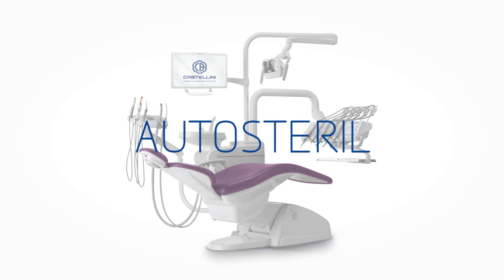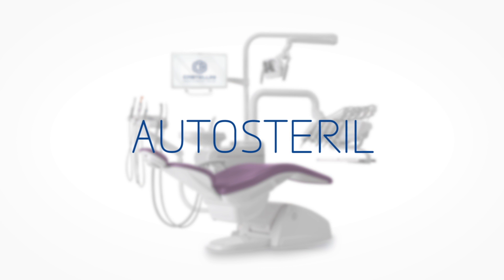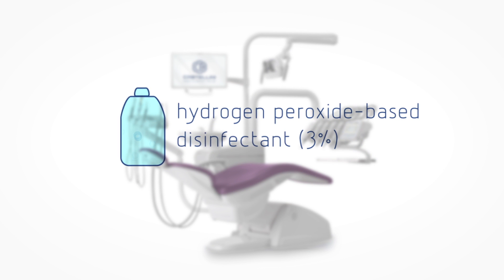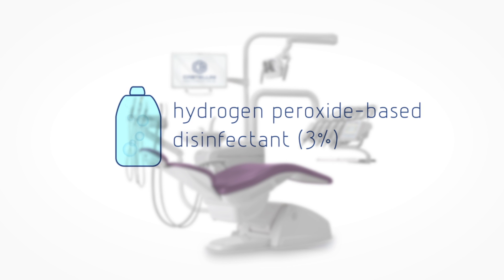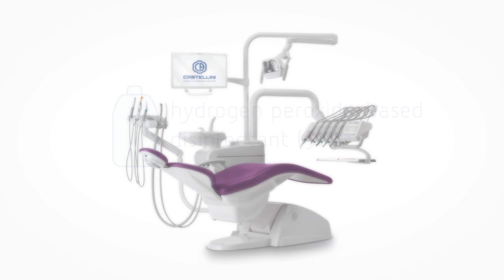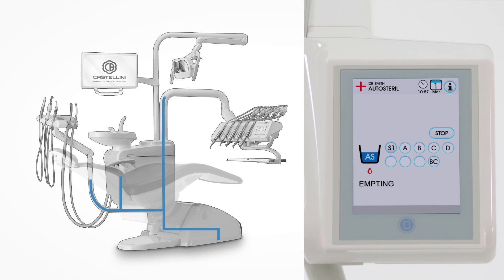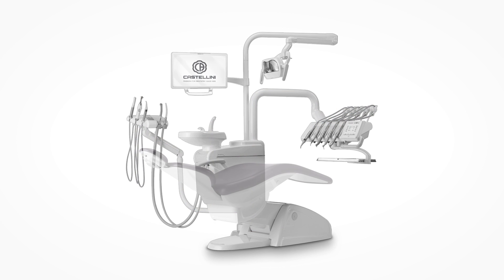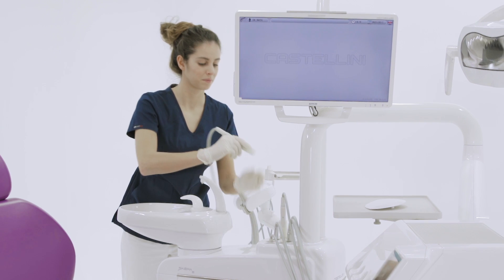The fully automatic auto-sterile system allows for fast running of dental unit water circuit disinfection cycles. The following steps are performed: emptying the instrument's water circuits, introducing liquid disinfectant and starting the disinfectant contact time until the required value is reached, then emptying the disinfectant and rinsing of the circuits. At cycle end, the full-touch control panel displays the message 'end of cycle, put back instruments.'